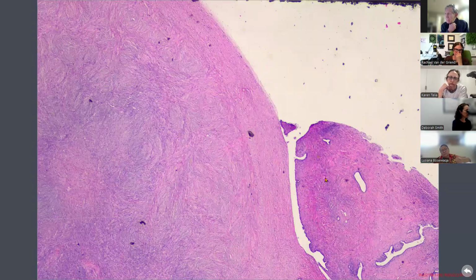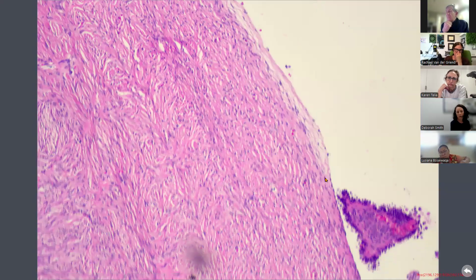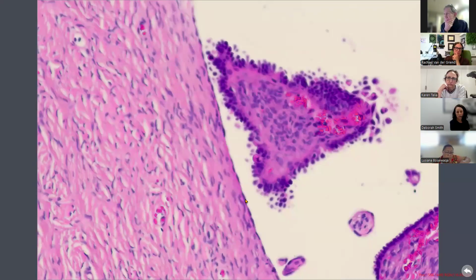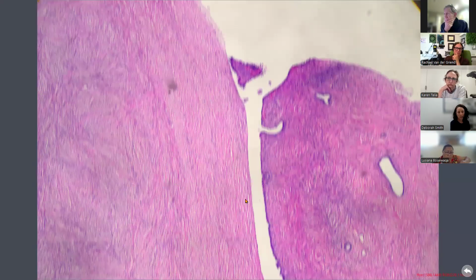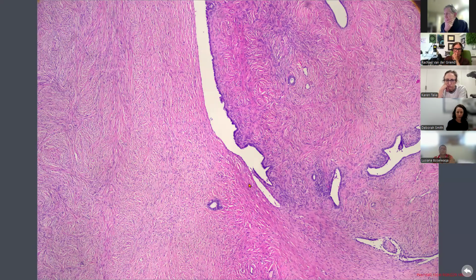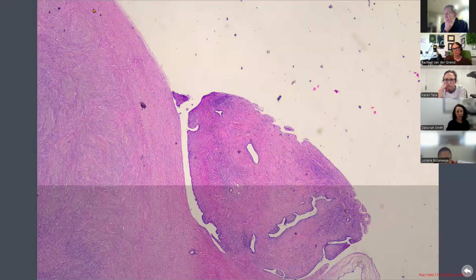One of the things I really like to do with these kinds of tumors, in the luxury of my practice, is to put a calretinin on them, because as soon as you do, you can start to see the architecture of how things relate. And in fact, as you come up the top here, this looks like mesothelium, that very flattened mesothelium that you can get stretching across an ovary. I do find that morphologically it blurs a wee bit. And obviously if you've got serous tumor involving the surface of the ovary, you can get both types of epithelium normally. So yes, indeed, this turns out to be the surface running across here.